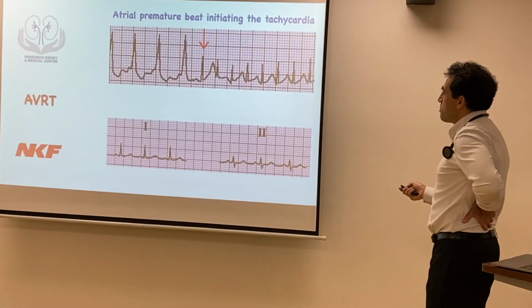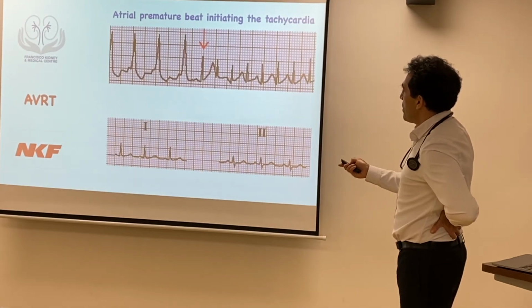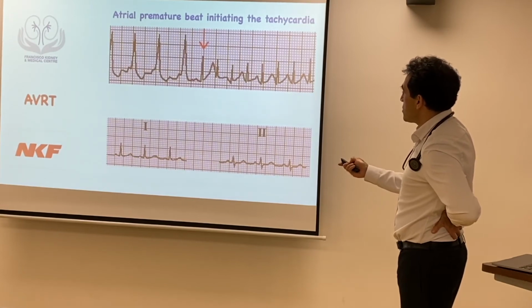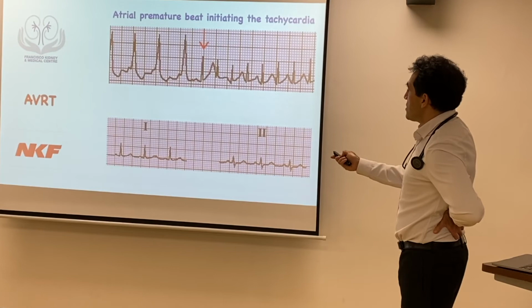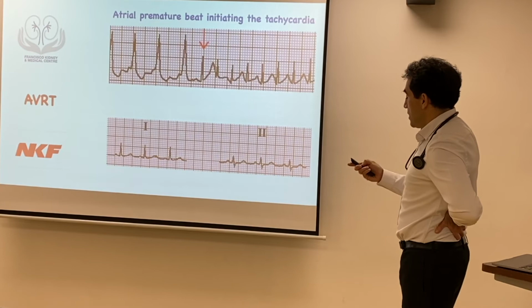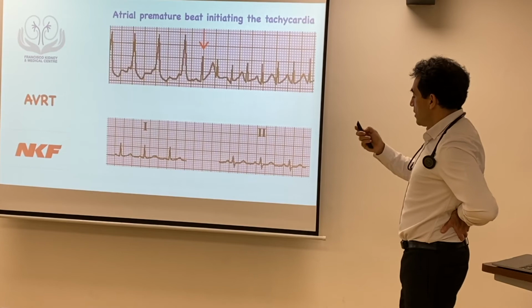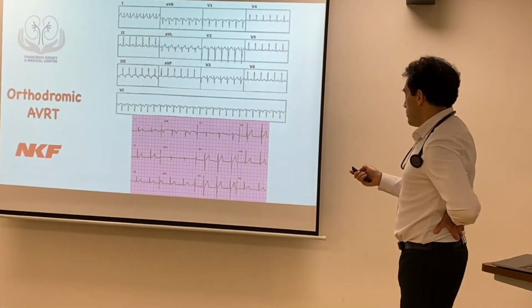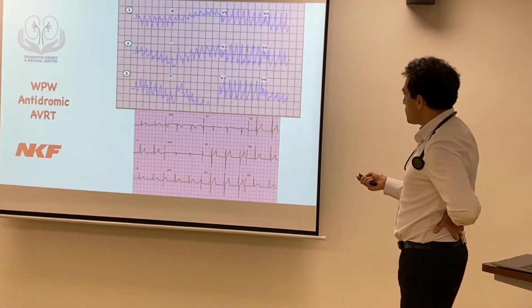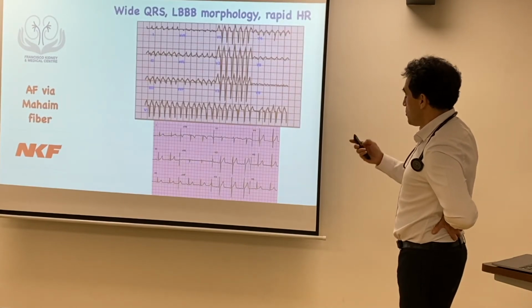Just skip it. I already showed you this slide, but it's also to show this premature atrial beat. There is the P wave, the QRS, and suddenly that triggers, because there is a reentrant pathway, a tachycardia, no? And it's AV reentrant tachycardia. I showed you, remember the slide with the heart and how it starts moving. The orthodromic, we already talked about it. Antidromic. This is another word, Wolff-Parkinson-White. But this is quite specialized, but you see, it's not normal.